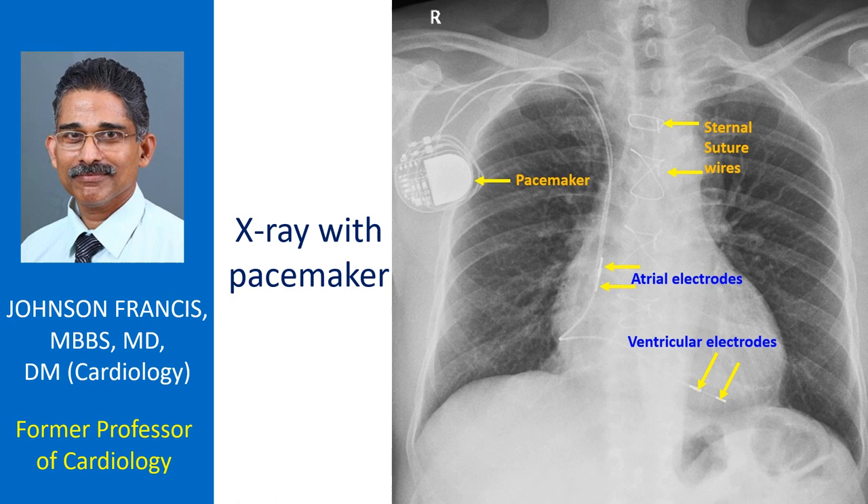In addition to the pacemaker and leads, sternal suture wires are seen, indicating a previous sternotomy which could have been a coronary bypass surgery or intracardiac repair of a congenital heart disease. No prosthetic valve is visible on the image, and metal clips usually used for left internal mammary artery harvesting are also not visible.